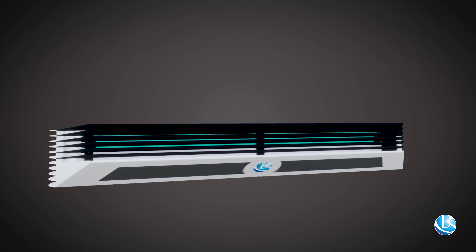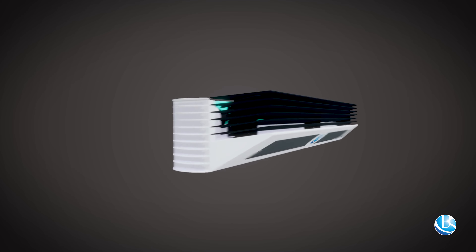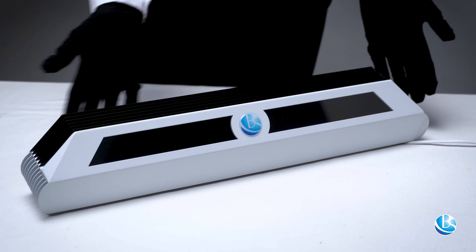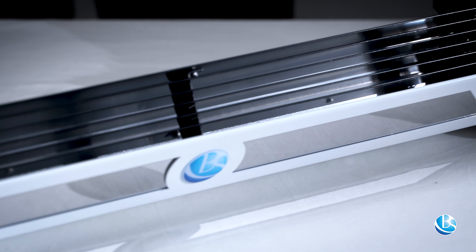They are installed at an angle of 90 degrees to the wall at a height of 2.4 meters or more from the floor. People can be in the room at this time, as the irradiator has a screen that protects against UV rays.